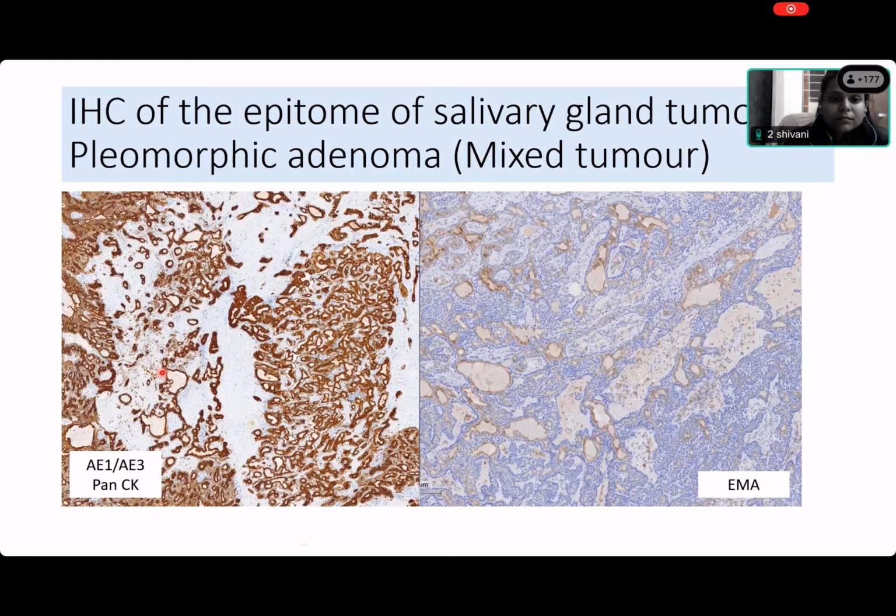No, ma'am. Come on, pan-CK, Shivani. You said pan-CK is positive in epithelial components and ducts. What does that mean? Ma'am, epithelial components are different from ducts. Yes or no? Ma'am, ducts are lined by the cells. Thank you. I know that ducts are lined by cells, Shivani. What cells line ducts? Luminal and abluminal cells. What are luminal cells and abluminal cells, please, Shivani? Ma'am, myoepithelial cells and the ductal cells. Shivani, you are just making up stuff.